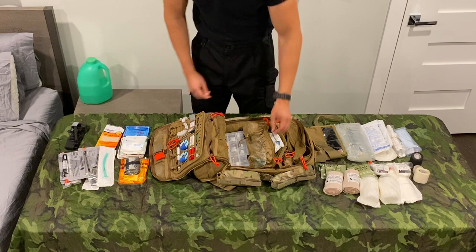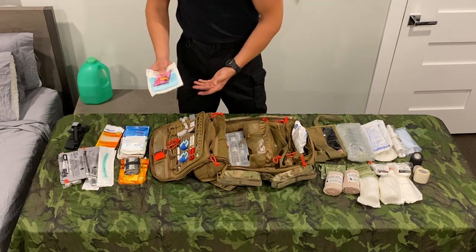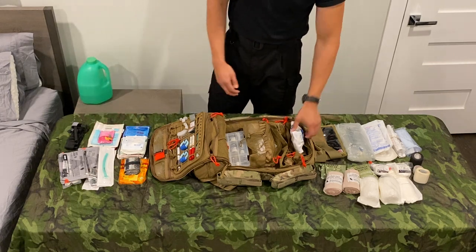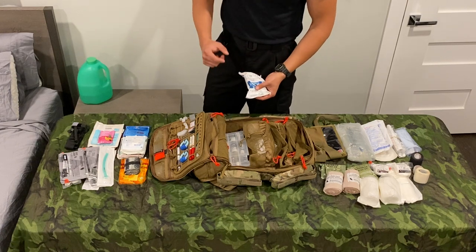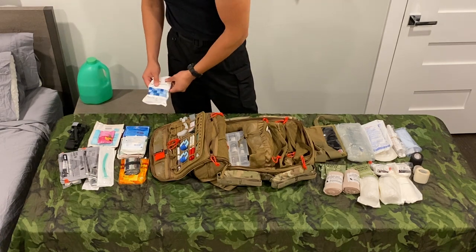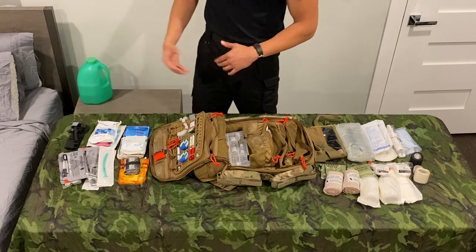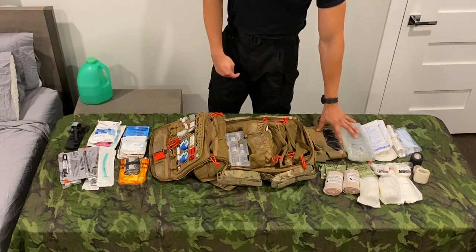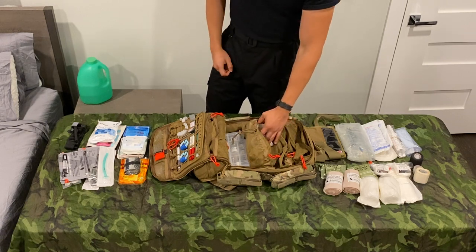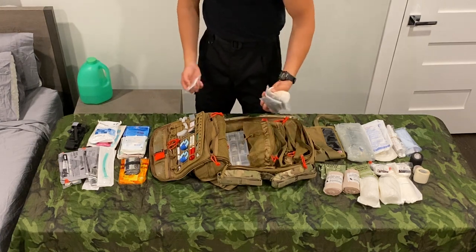Moleskin padding — something every medic should have. Your feet are going to get torn up when you're rucking and training all day. These two things are medications that don't fit in my med box, so they're in here: transdermal lidocaine patches for some basic pain relief, as well as oral glucose for diabetic emergencies. Not that anybody I roll with is diabetic, but it doesn't hurt to have. I might move to the chewable tablets though. Cold pack can be used for some cooling — if somebody's heat-casing, you can use it with the pulse points to bring their core temperature down, or put it with your fluid to cool them kind of passively. Obviously if somebody is too far along in their heat casualty situation, you're going to want to cool them with water instead.